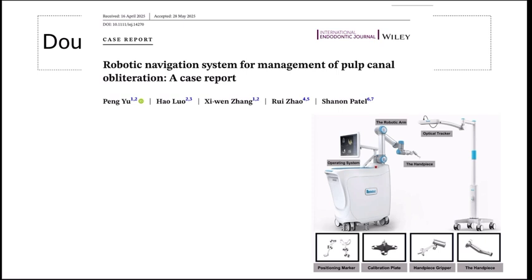To overcome this issue, dynamic navigation was introduced, incorporating the CBCT and intraoral scanner, but enhancing the precision by using positioned reference markers. Stereo cameras track these markers in real time, and the handpiece is equipped with markers that are registered and synced with the reference systems. This allows real-time guidance and potentially reduces iatrogenic errors.